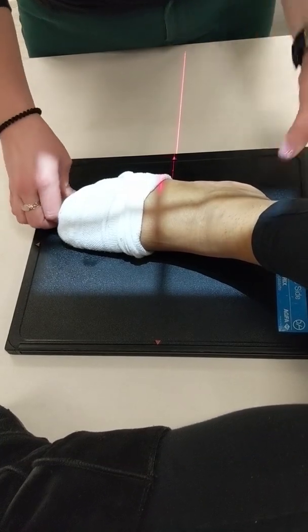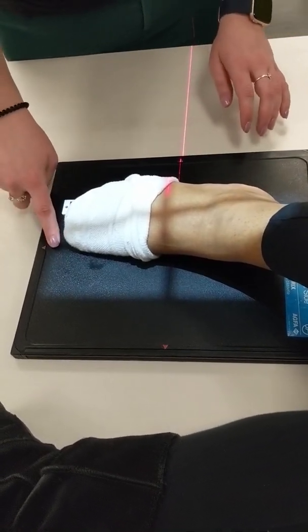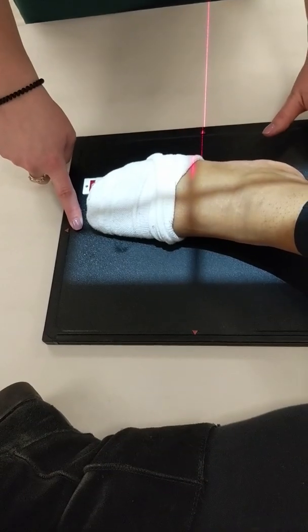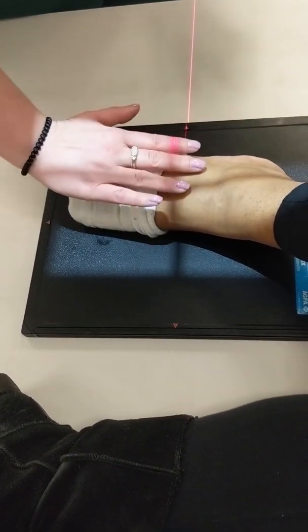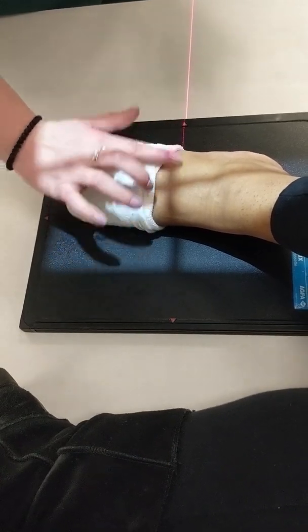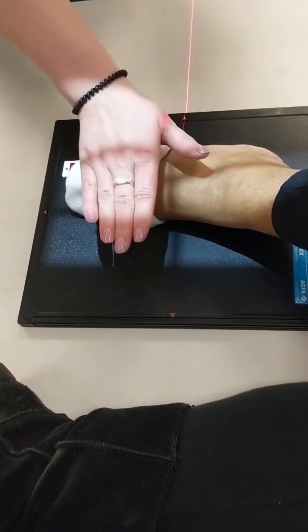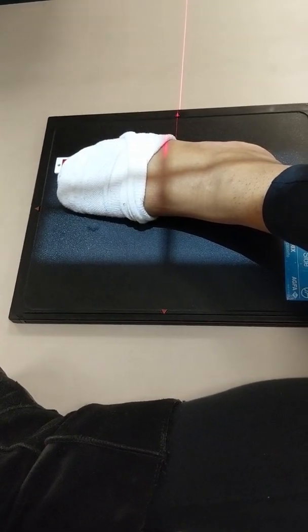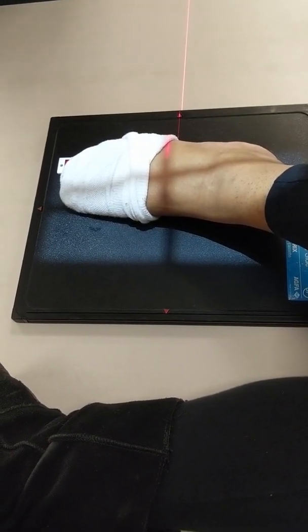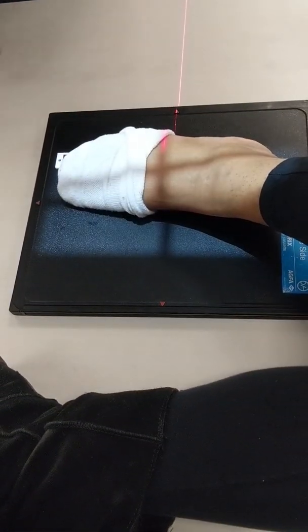That's better. Okay, so we still have light to include her toes and her calcaneus. We're centered on the base of her third metatarsal. She's rotated internally until this dorsal surface of her foot is parallel with the IR. We went back up to a 40-inch SID. She's still shielded from the previous projection. What are her respiration instructions? Hold still.